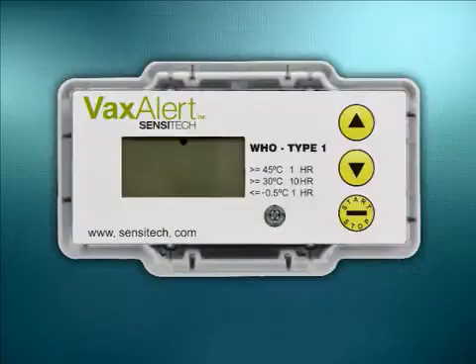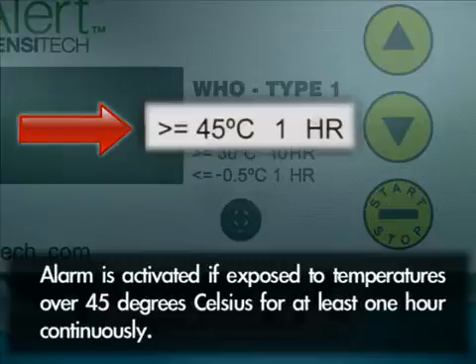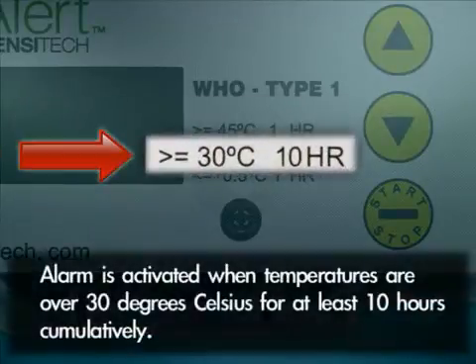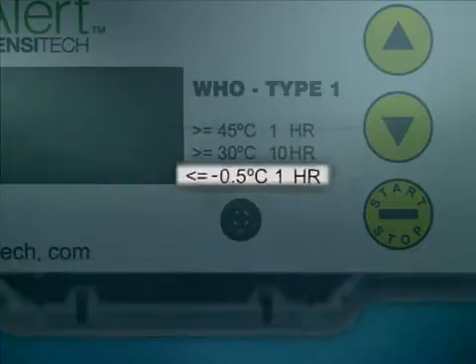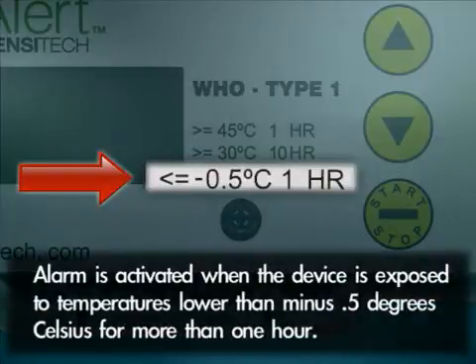In Type 1, the 45 degrees Celsius alarm is a single alarm for 1 hour or more. This alarm is only activated if the package is exposed to temperatures over 45 degrees Celsius for at least 1 hour continuously. The 30 degrees Celsius alarm is activated when temperatures are above 30 degrees Celsius for at least 10 hours cumulatively. The -0.5 degrees Celsius alarm is a single alarm activated when the device is exposed to temperatures lower than -0.5 degrees Celsius for more than 1 hour. This exposure must occur continuously for the alarm to trigger.